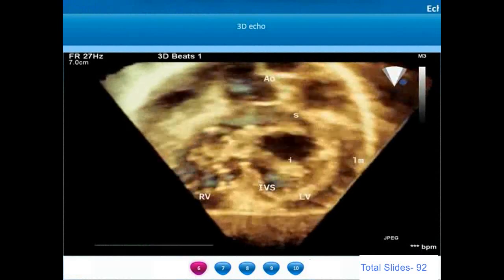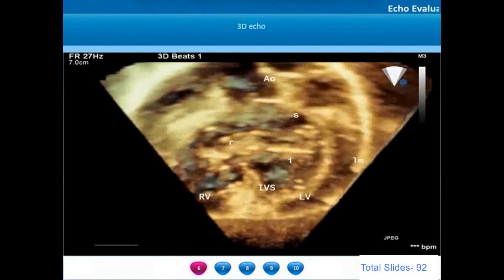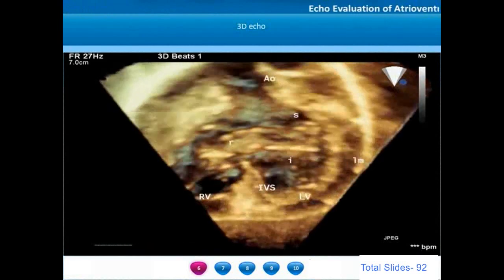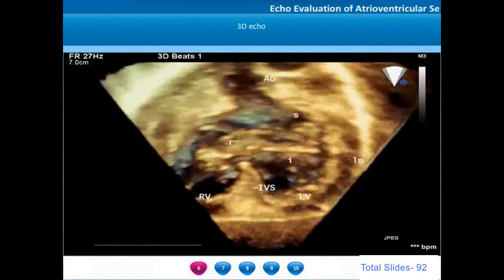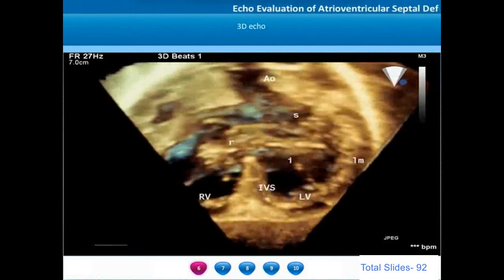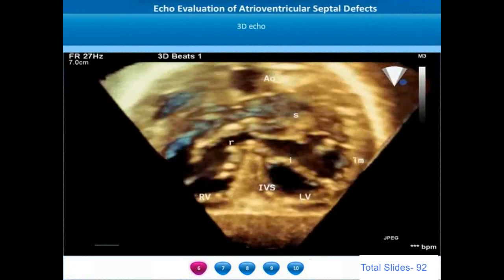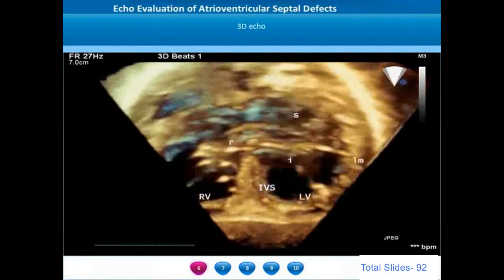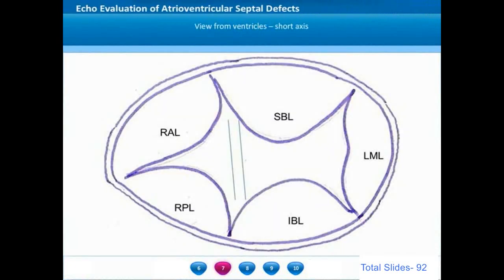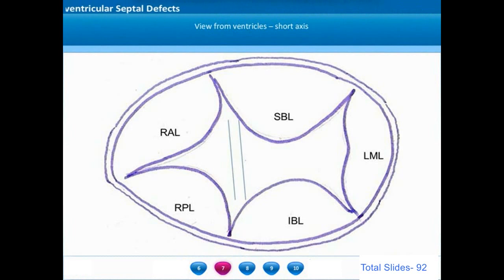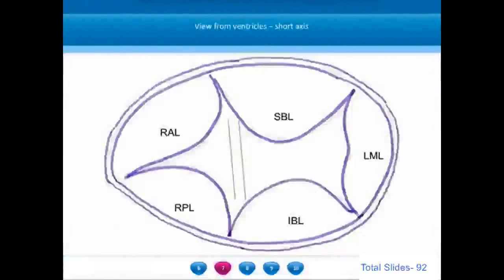We can notice that the aortic root is anteriorly displaced. Normally the aortic root is wedged between the left and the right atrioventricular valves. However, in AV septal defects the aortic valve gets anteriorly displaced.